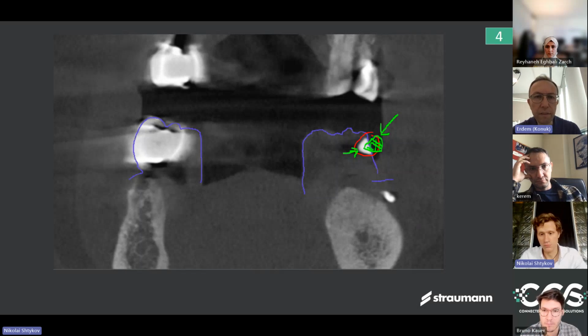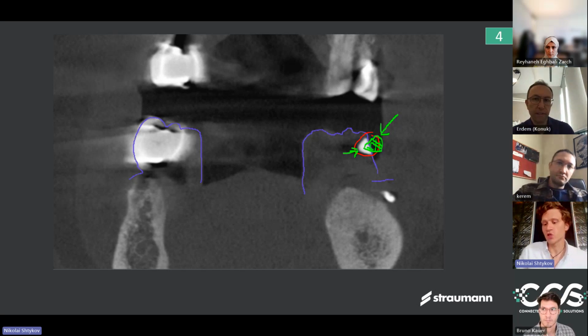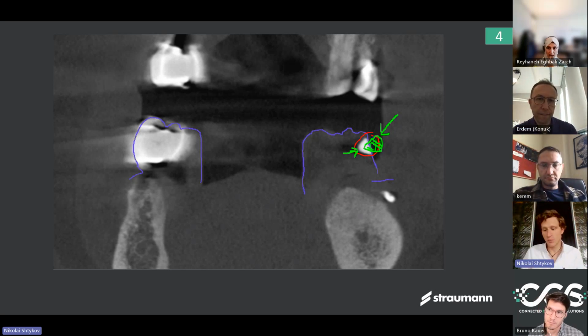Thank you. Everything is understandable. We are also using composites, the dual scan technique, and contrasting teeth as well, which are barium sulfate containing teeth. So we are using the same technique as well. Okay. No question. That's good that you understand these methods. I just described this, and if you already know these methods, I can go faster.